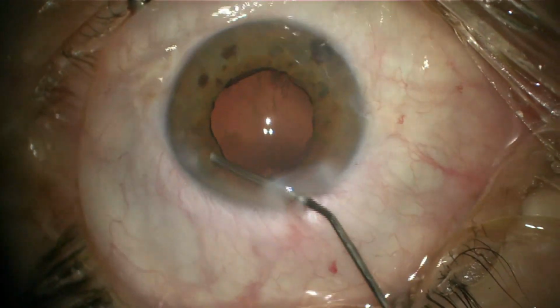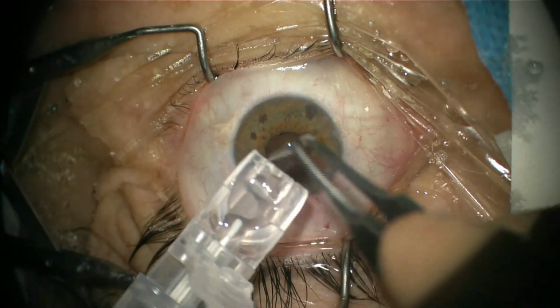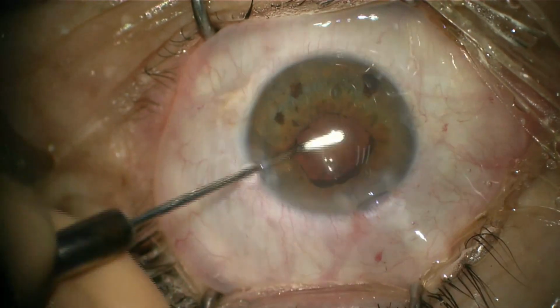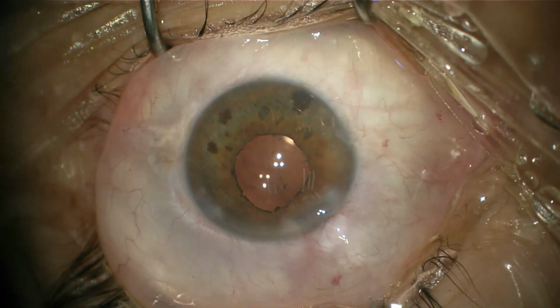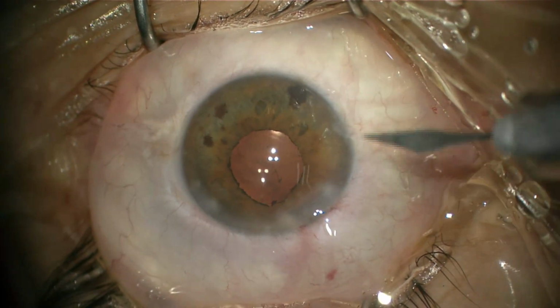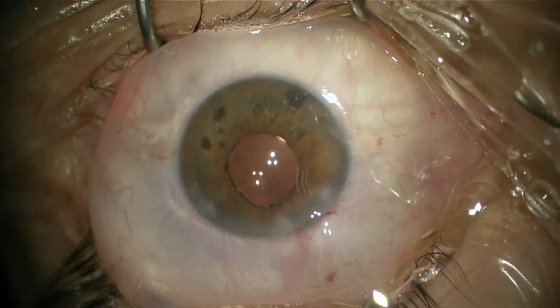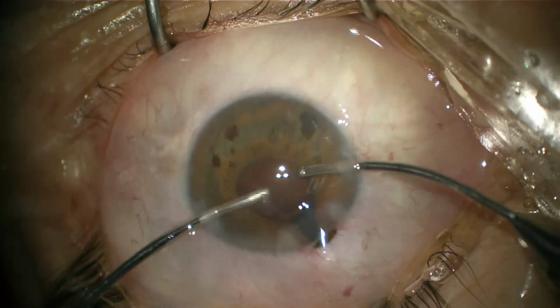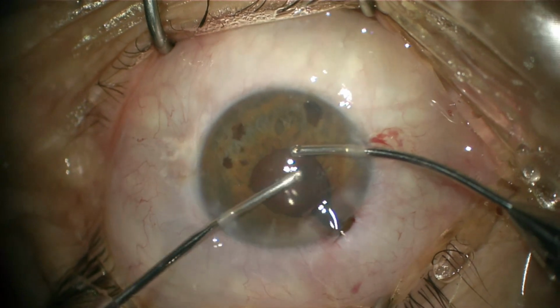Now here, you can put the IOL in the back and rotate the lens to release the cortex. Here comes the IOL in the back and rotation is made. It loses a little bit more of the cortex, but again the iris comes out. Here is another option. Put a second accessory incision for doing bimanual irrigation aspiration. So with bimanual AI, you can easily reach the periphery, but guess what? The iris still prolapses.